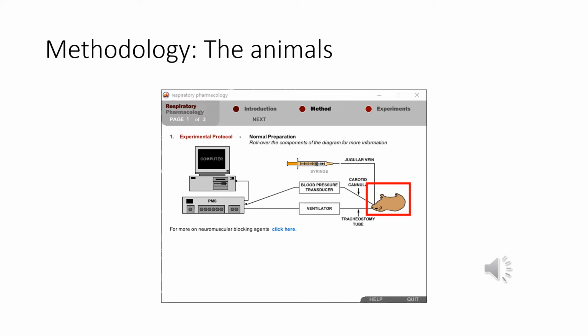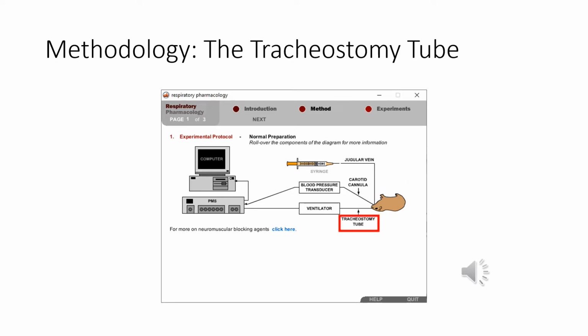Body temperature is monitored via a rectal probe and maintained at 38 degrees Celsius by a heated blanket. Tracheostomy tube. The trachea is cannulated to allow oxygen ventilation at 1 Hz and 8 ml per kg and to measure the tracheal airflow pressure. Tracheostomy is performed between the second and third cartilage rings from the larynx and a polyethylene cannula is inserted. Animals are ventilated with room air.